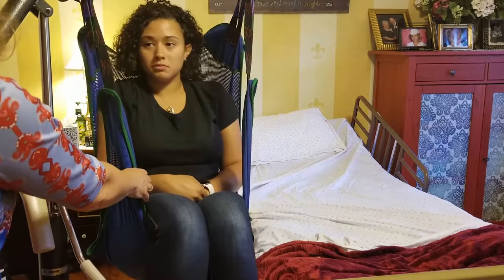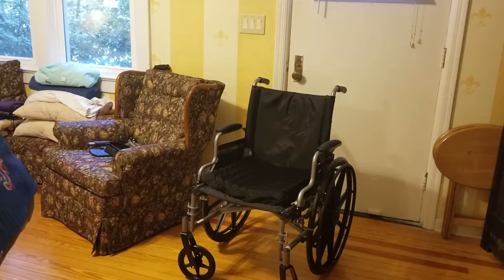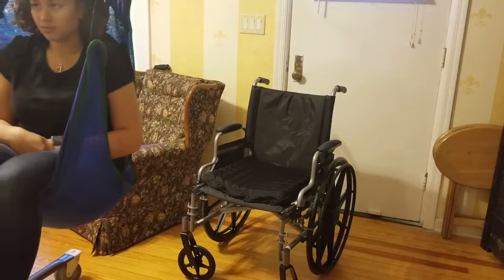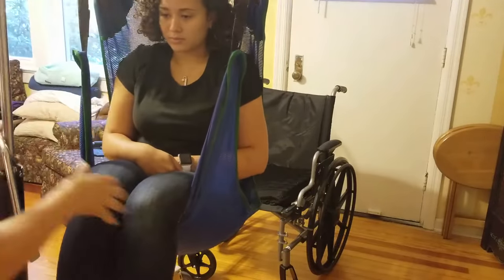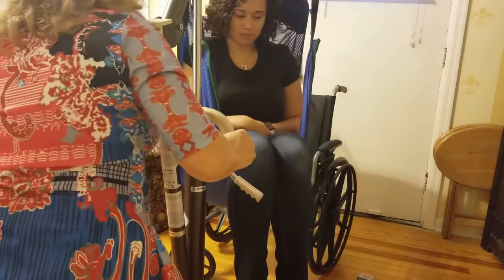Make sure the wheelchair wheels are locked — very important so the chair doesn't go flying. Come across the room with the sling and the lift. If you have two people to help, that's great, but if not, just go slow. Make sure the legs of the Hoyer are open for stability. You may need to remove the leg rests from the wheelchair to maneuver around them. When you get to the chair, guide the person to sit nice and upright.